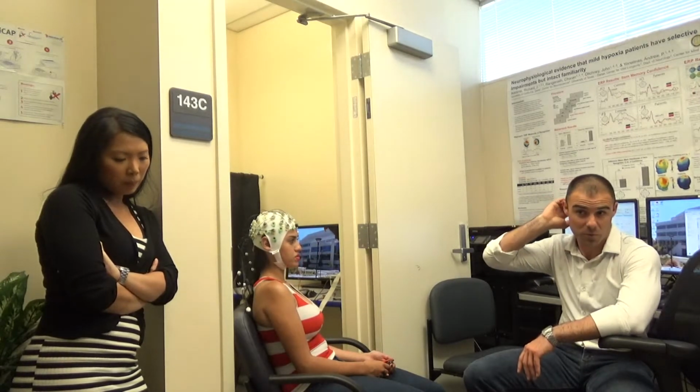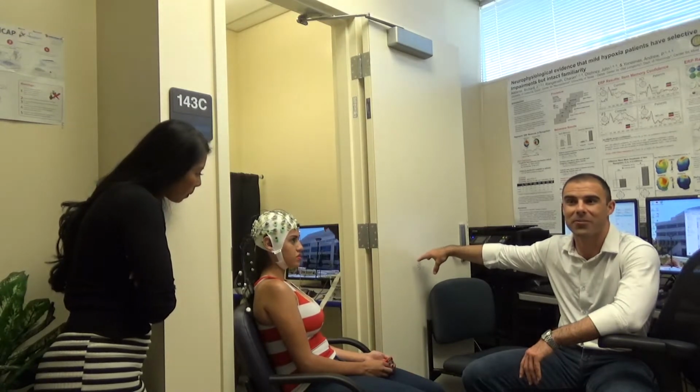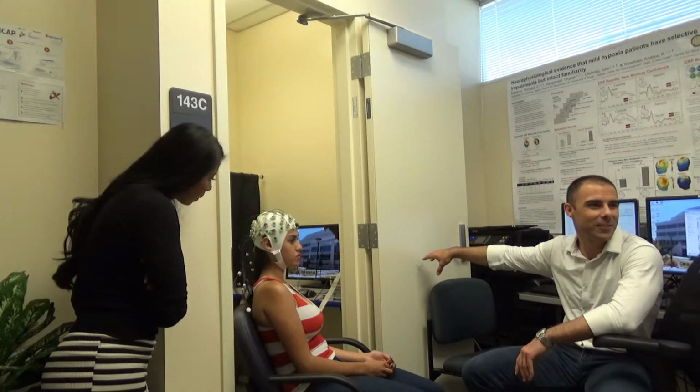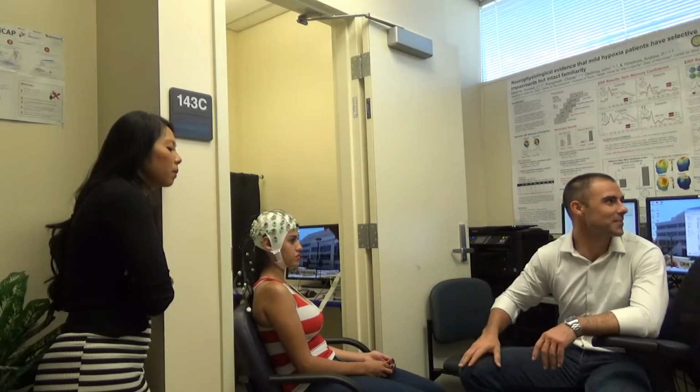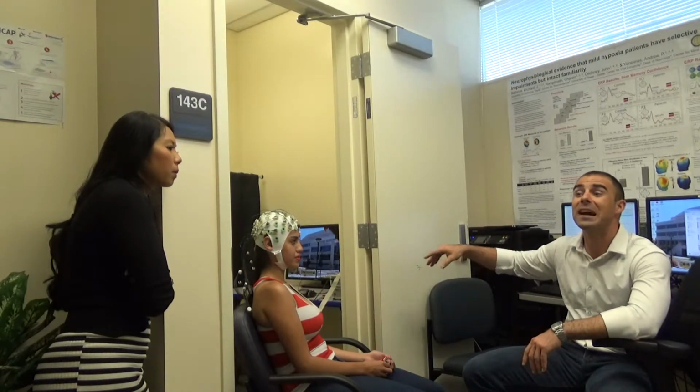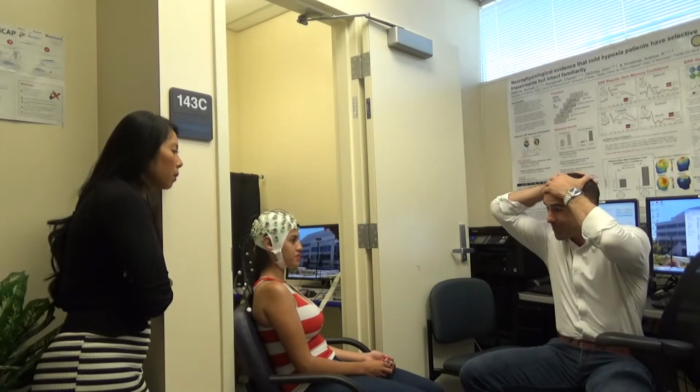So anyways, when we start to clean up the electrodes once the experiment is done, she's still connected to the computer, right? That started our little conversation about the brain-computer interface. We first want to make sure she doesn't, because sometimes the subjects get used to it. You kind of forget what your whole contraption is like, and it's easy to just say, oh, we're done, and get up and start walking away. And you're like, no, you're connected.